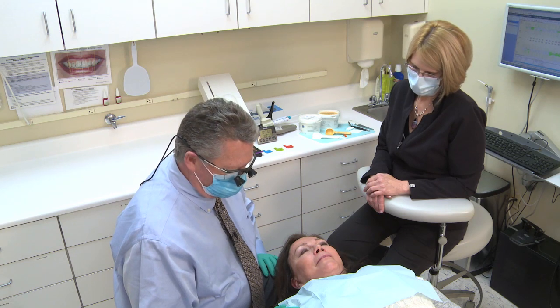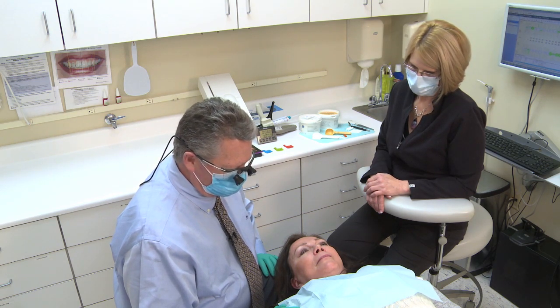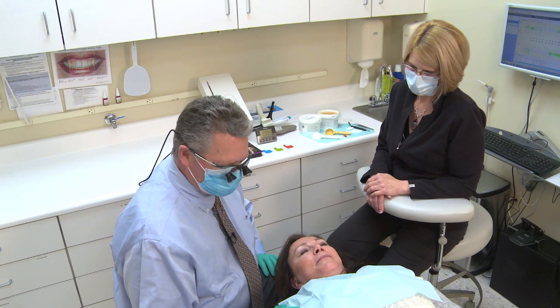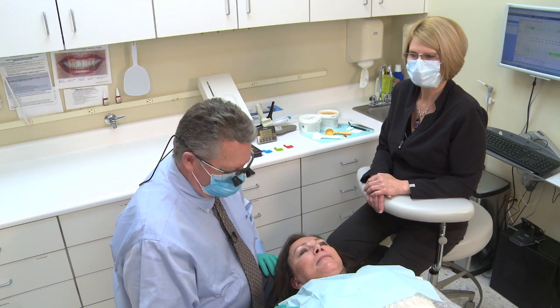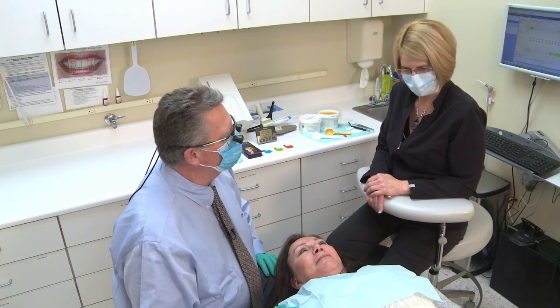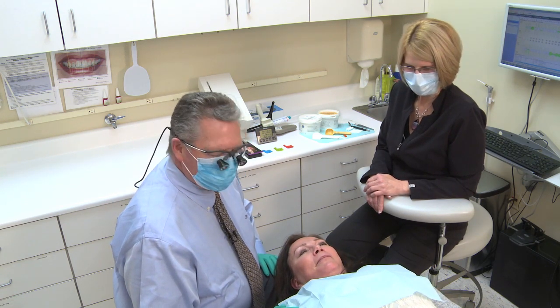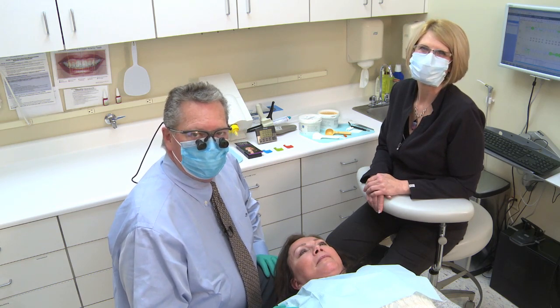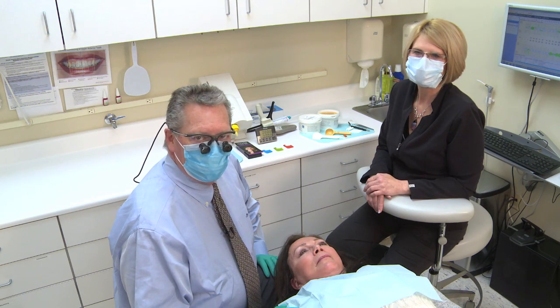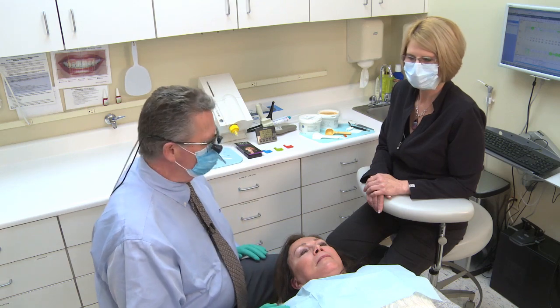So you reported on your health history that you have some nasal issues, that you have a hard time breathing at night, and that you snore. Is that correct? Yes. Great. So Kim, we want to hear your best snore. Let's hear your best snore. Tammy, what do you think? One more time, Kim. There you go. So what you want to do is encourage your patient to give you their best snore. And that becomes the interactive component of doing the bite registration system.